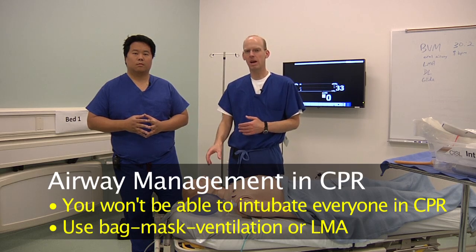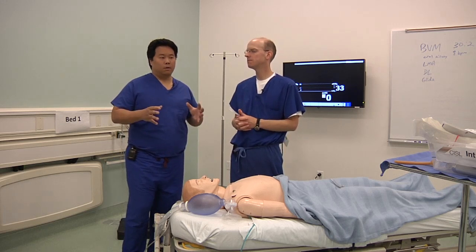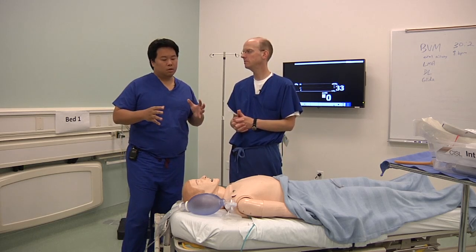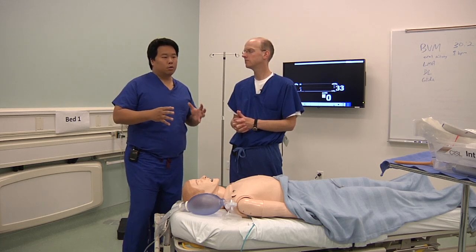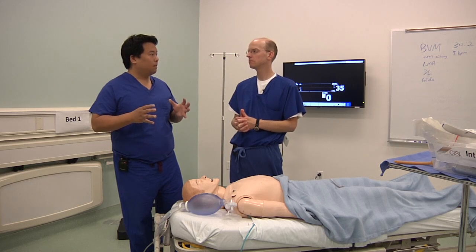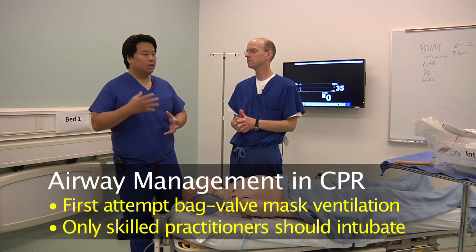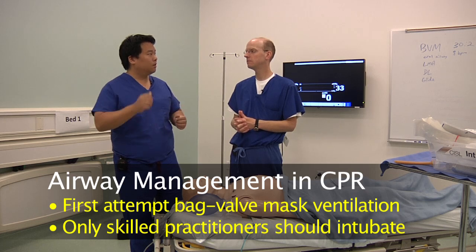So we went over bag mask ventilation before. We talked about laryngeal mask airway. So I think that's something to discuss. So let's recap a little bit. If you're coming to a situation where the patient is having a cardiac arrest and compressions are occurring, you should try, in terms of managing the airway, to do bag valve mask ventilation. If you can establish ventilation through that method, then you don't necessarily need to move immediately to tracheal intubation.